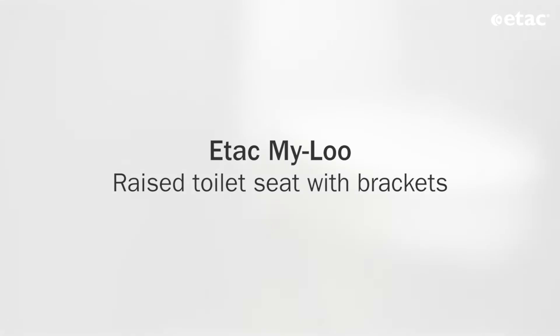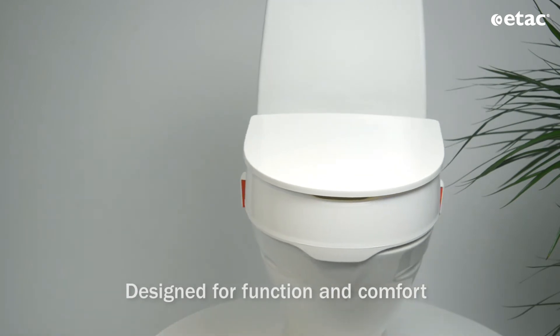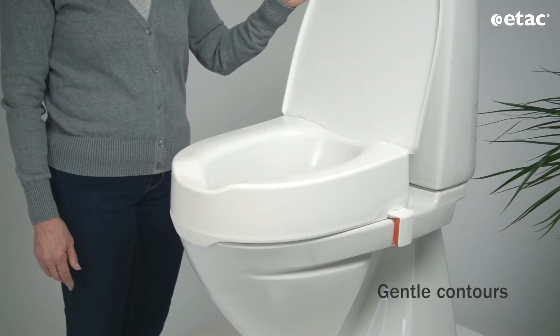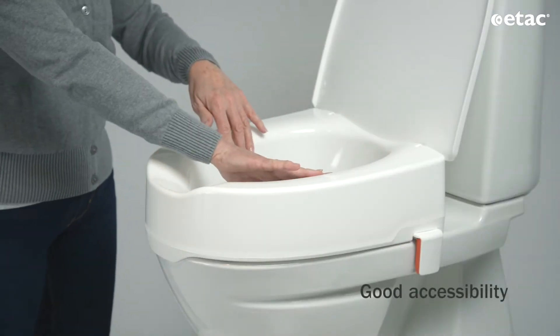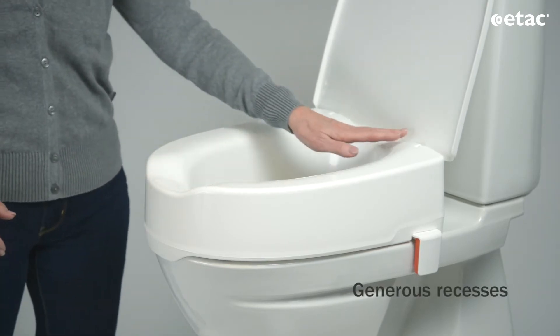MyLoo with Brackets is part of a new generation of toilet aids from ETAC. With excellent design and ergonomics, it provides comfort and security for the user. The gentle contours and generous opening make MyLoo suitable for most people.